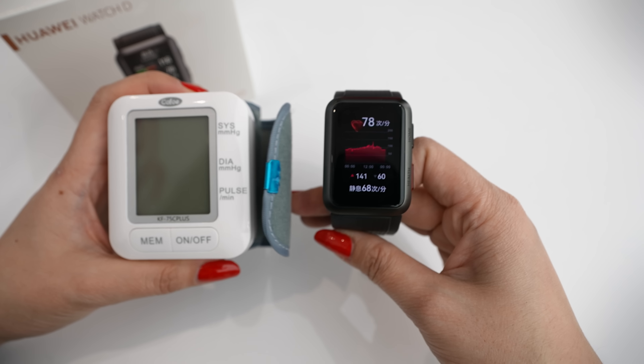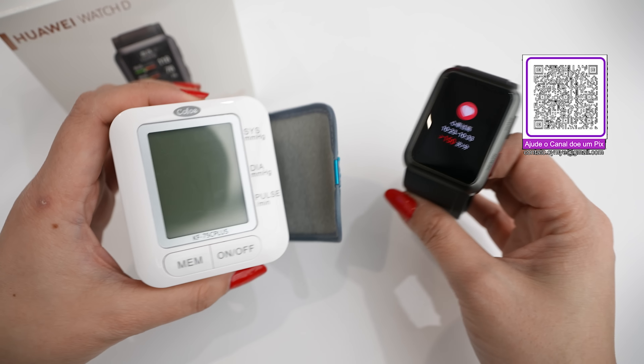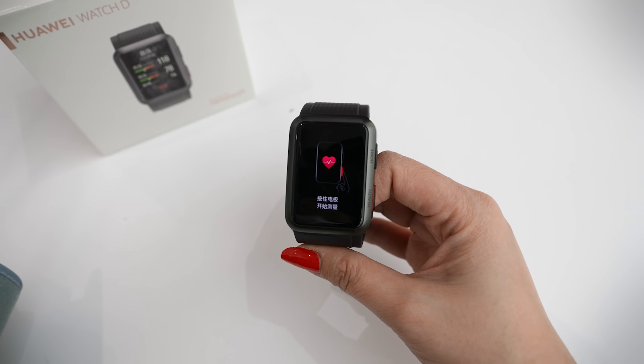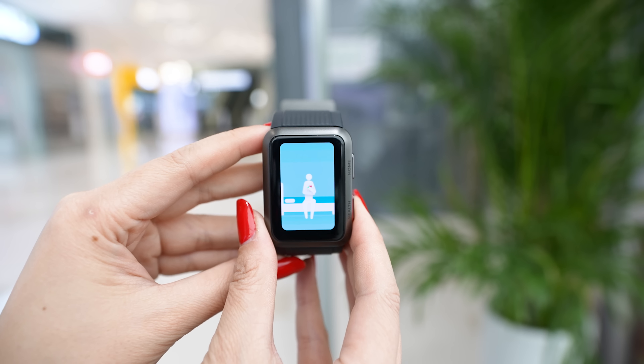Just from the camera, you can see that it is much better to carry something like this than to carry a traditional blood pressure device. The traditional device will only have the function of measuring your pressure, while this has many more functions. Before we test it, let's look at the features it includes.